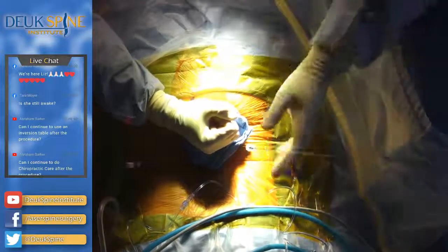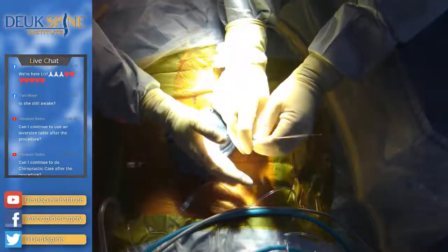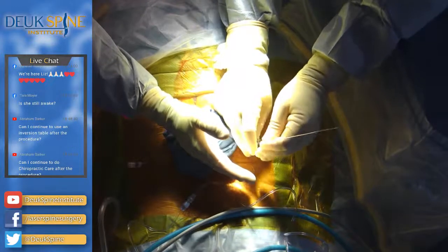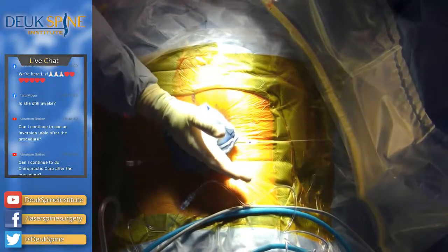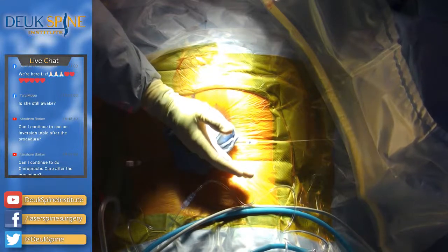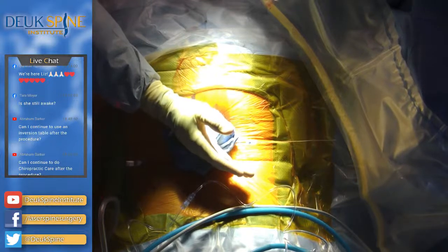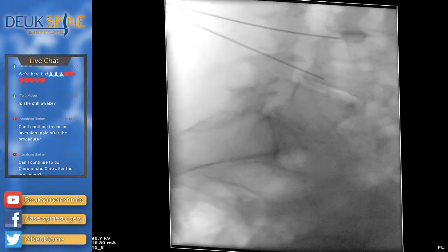One thing I've seen with the laser surgery too is that we've been able to. Is that our view right there? I understand. Let's zoom in a little more. Bring the emitter closer to the patient so I can get a better view.